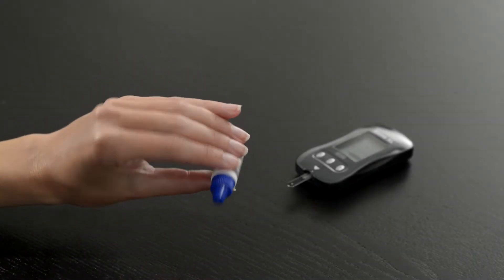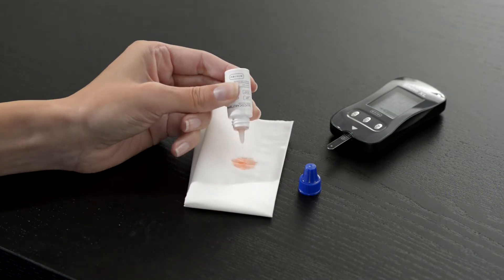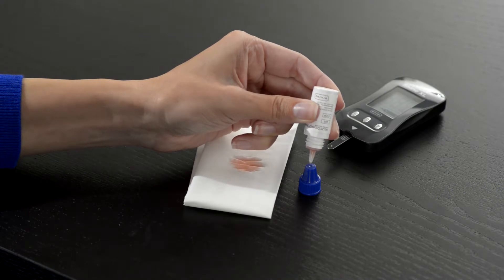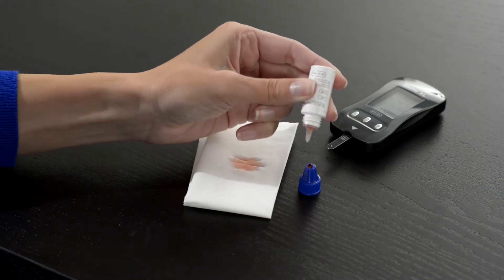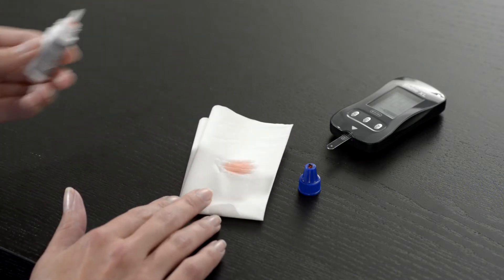Shake the Glucocard Shine control solution and discard the first one or two drops. Dispense a drop of control solution onto a clean non-absorbent surface — we suggest the tip of the bottle cap. Wipe clean when done testing.